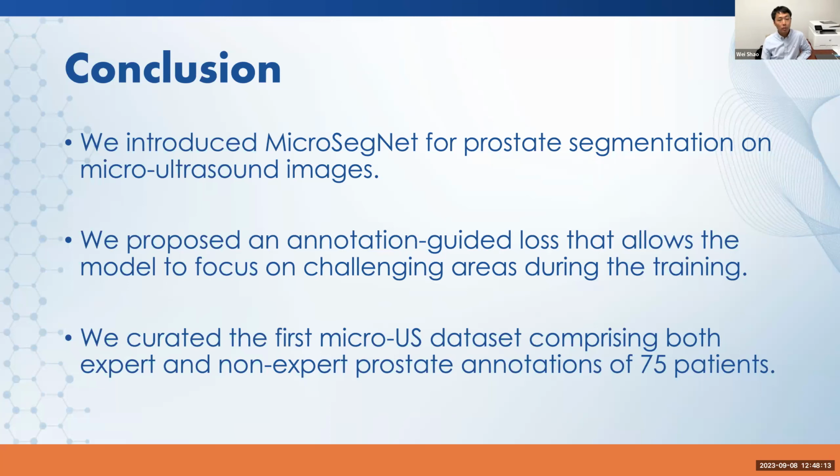And finally, we will make our dataset publicly available. So we created the first publicly available micro-ultrasound dataset with expert annotations, which is provided by most datasets. But in addition, we also have those non-expert annotations telling us where the regions that are hard to segment are.